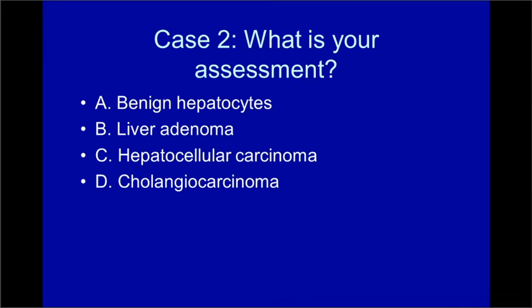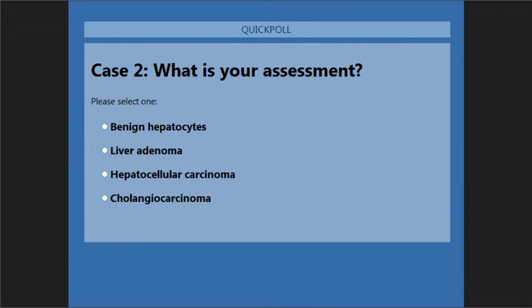I'm not sure if I'm supposed to describe them, but I did. So what is your assessment? The polling can start, yeah. Thank you for the tips on that case. Yeah, I know. I think I gave it away. I think I should have just shown you the images, but okay.